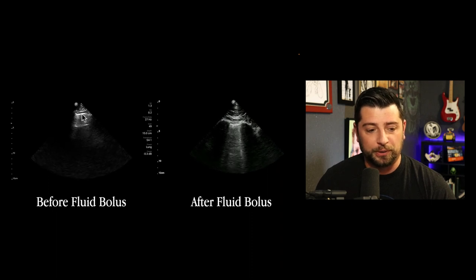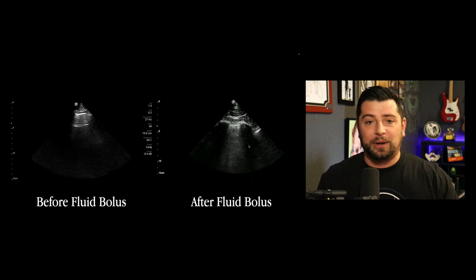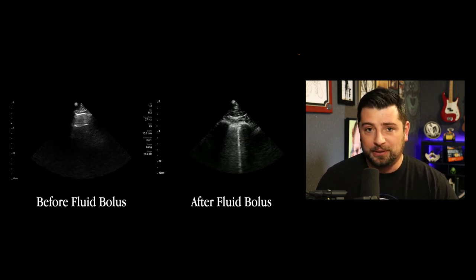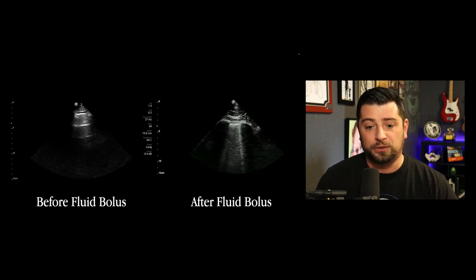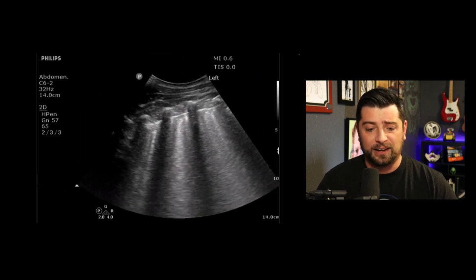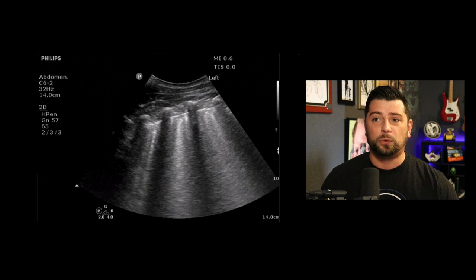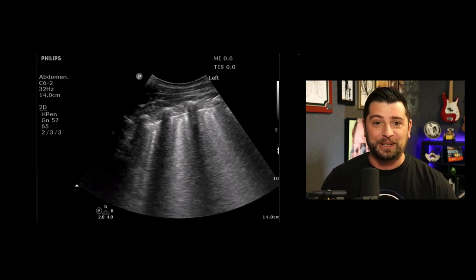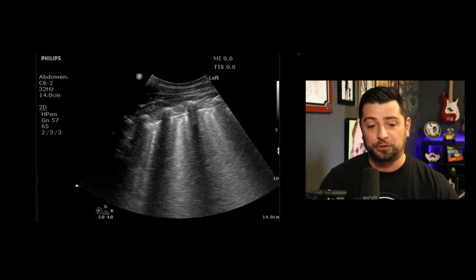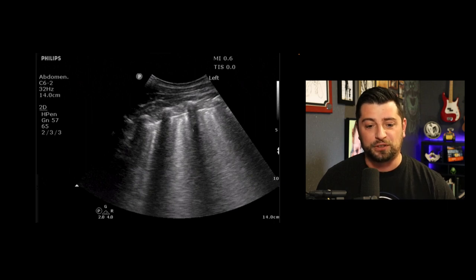Before fluids you see nice A-lines — horizontal lines. After fluid, looking in the exact same spot so you know it's a trend, if you start seeing vertical lines appear, your spidey senses should be tingling. Even if it doesn't fully meet B-line criteria, that's concerning. And in this image, you can see a bunch of B-lines getting on the border of consolidation — what they call hepatization of the lung, where the lung starts to look like the liver. It's completely full of fluid, with that same echo texture as the liver.